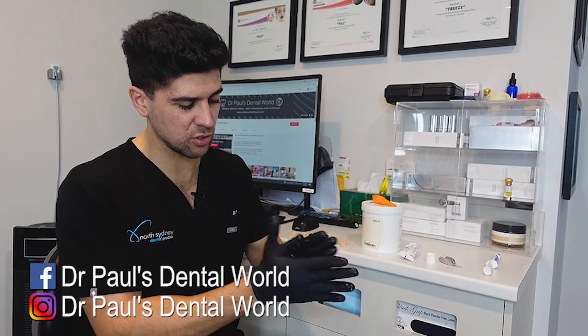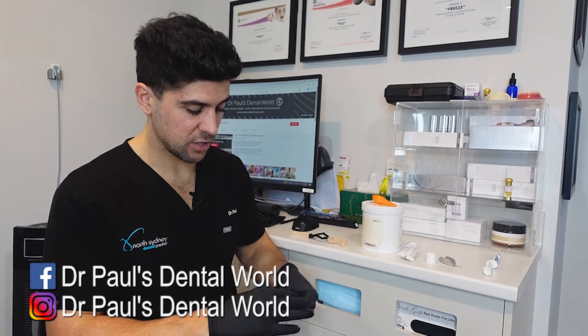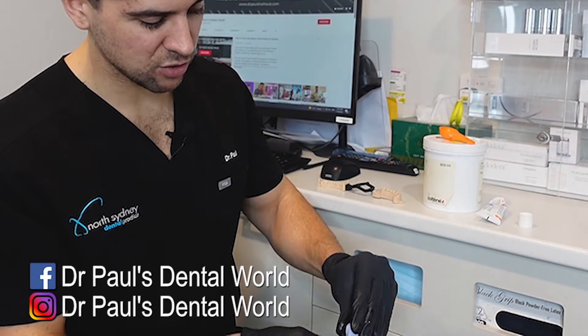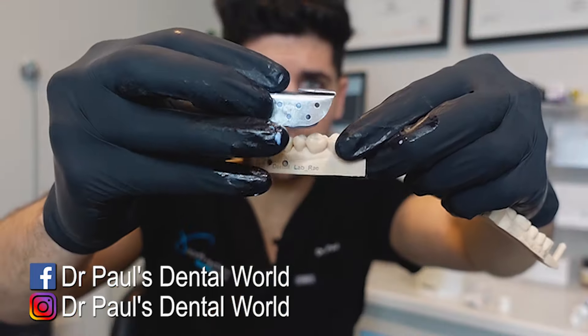Now we use gloves for this because the putty that we use gets quite messy — otherwise it gets underneath your fingernails. You don't need a huge amount; you need enough for the tooth that you're working on, and then for a couple of teeth either side. Then you're going to put that in your tray. So it'll go in like this, then it's gonna go over the top of the tooth.